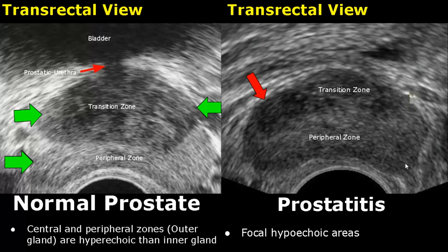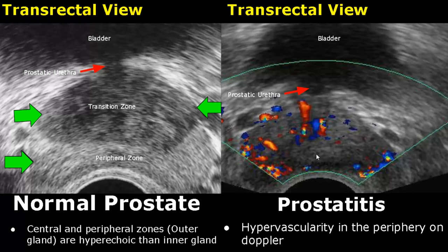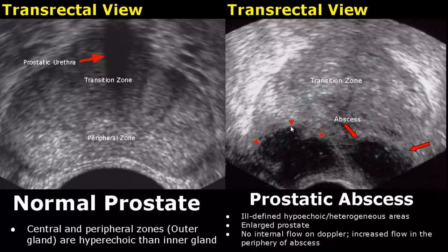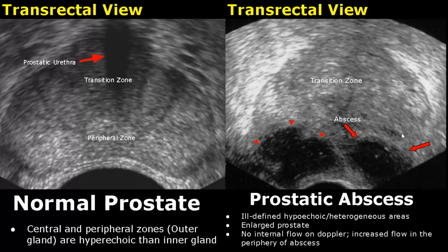Prostatitis is the inflammation of the prostate. The appearance may mimic prostate cancer because it also contains focal hypoechoic areas, but the peripheral zone is mostly clear. On color Doppler, increased vascularity is noted, suggesting inflammation. Prostatitis can lead to an abscess, which will appear as an ill-defined hypoechoic or heterogeneous area. The prostate will be enlarged, with no internal flow on Doppler, but increased flow in the periphery of the abscess.